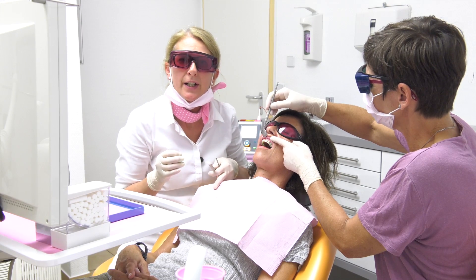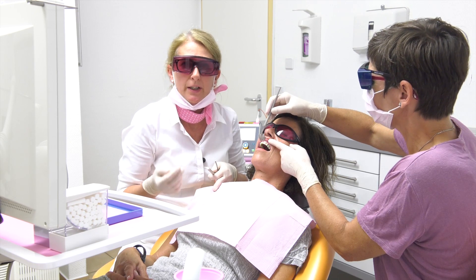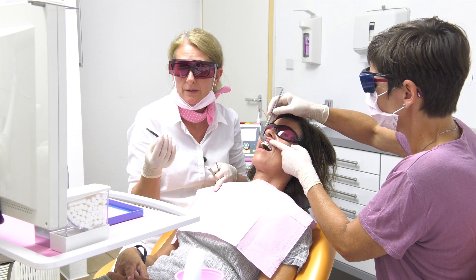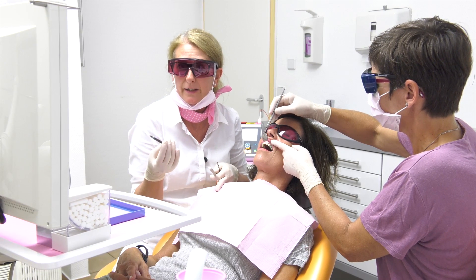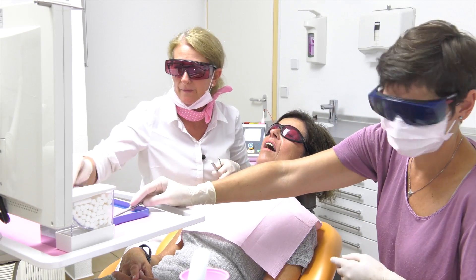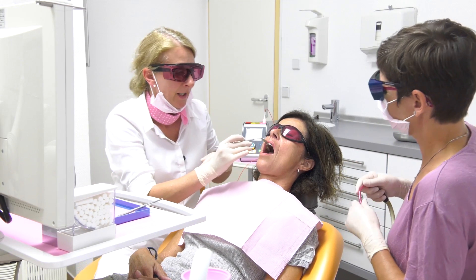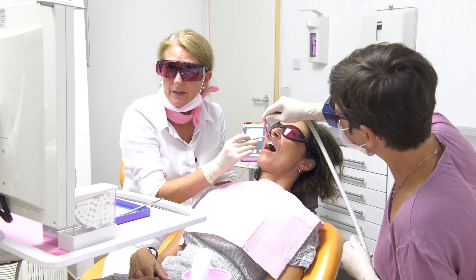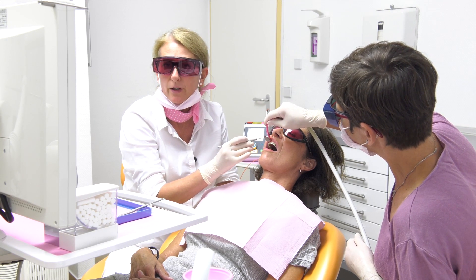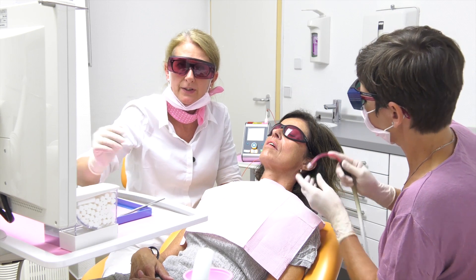Just in case you decide to take the blue dye, you only need one fibre. When you take the green one, you need three light fibres, and you have to repeat the workflow three times. Now we take off the saliva ejector, take off the old dye, and the treatment is done.